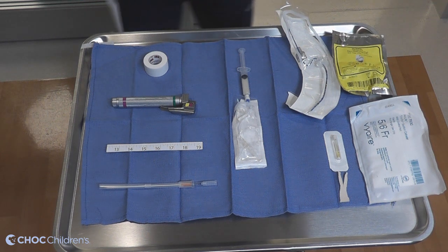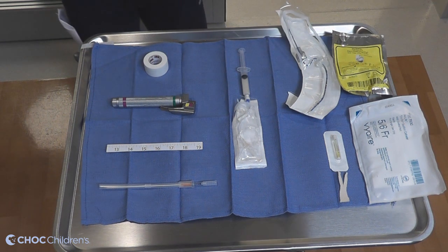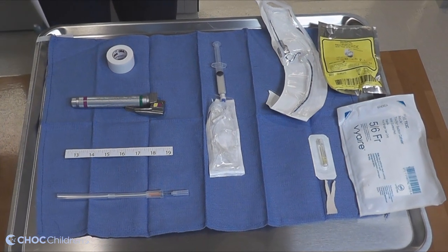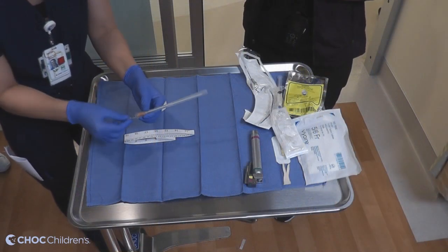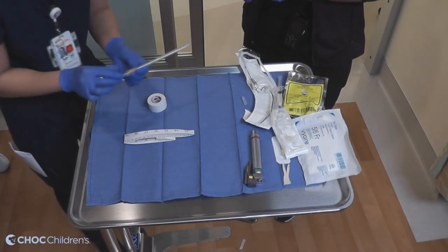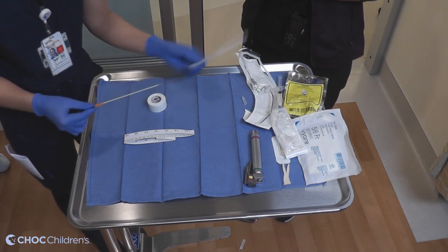Equipment for manual PPV and emergent intubation. For example, a neopuff, suction catheter, ET tube, CO2 detector, and a TCOM. Next, we'll talk about measuring the catheter depth. You will remove the needle from the angiocath and discard it in the sharps container.